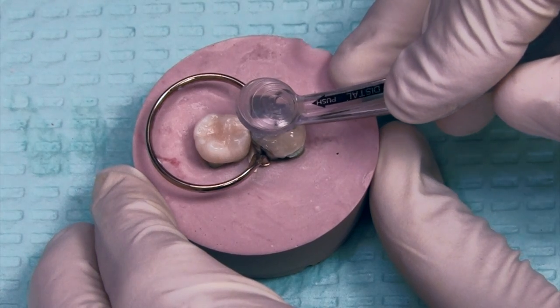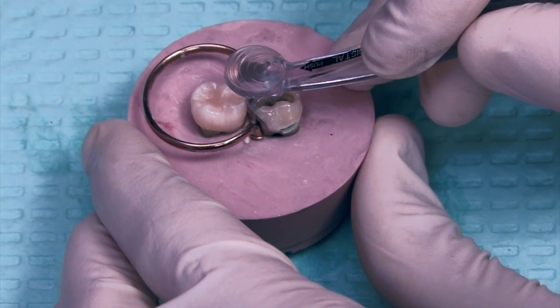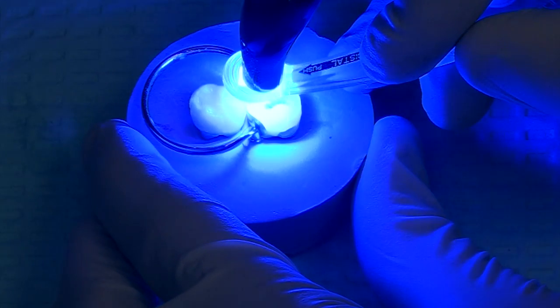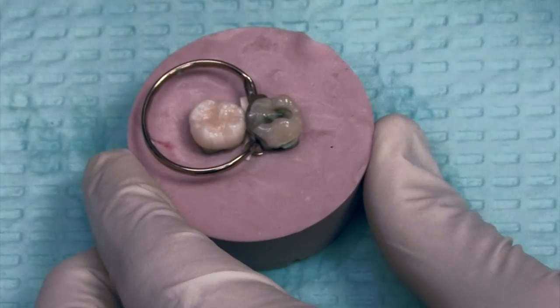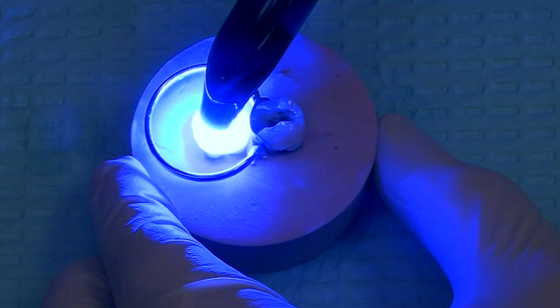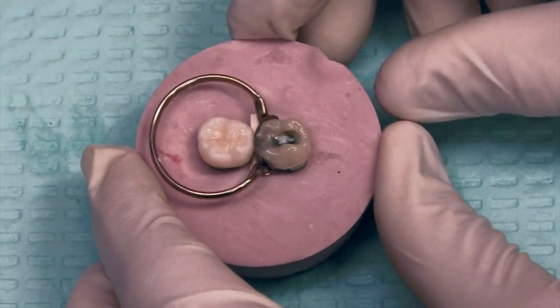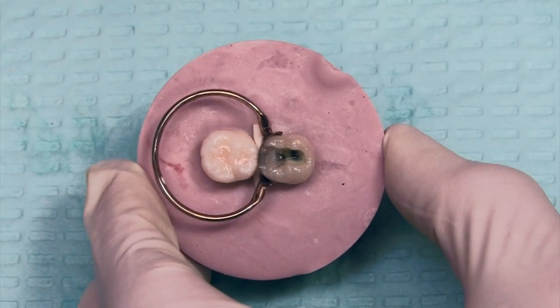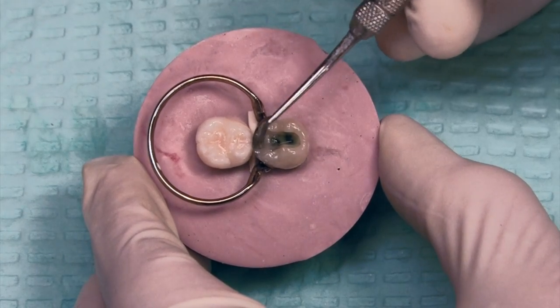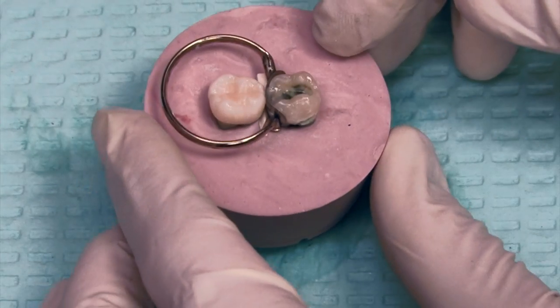Now going to that interproximal box, I'm putting in that contact former. I'm pressing down, rotating it up, and my assistant comes in with the curing light right on top of that platform to cure the top, and that will go all the way down to cure that gingival box. I'll then go in and cure the other tooth — five seconds is required. That instrument is going to leave an indentation inside that prep. That needs to be filled in to make sure there are no air bubbles.